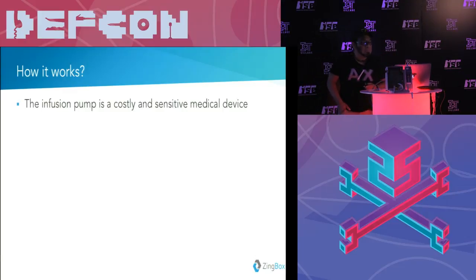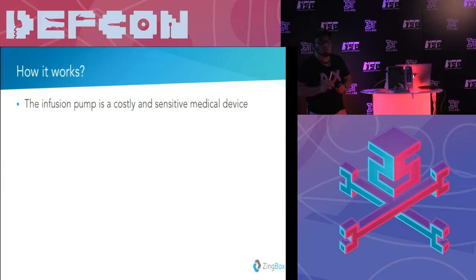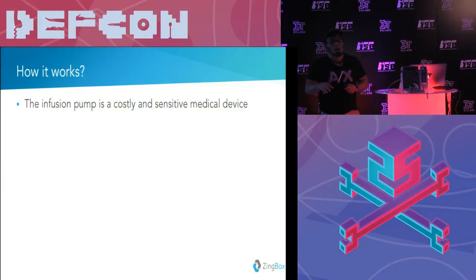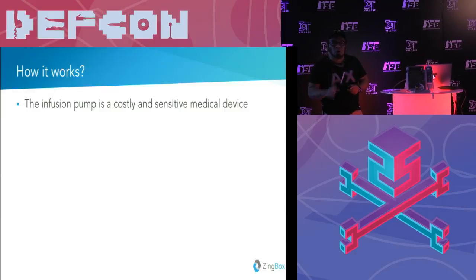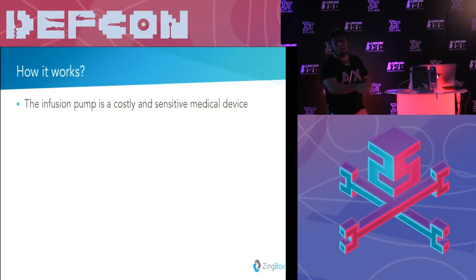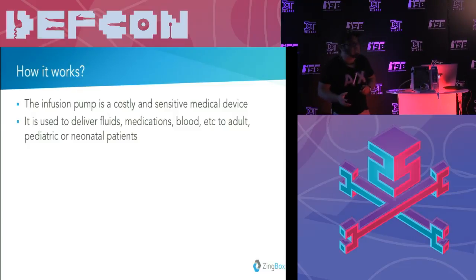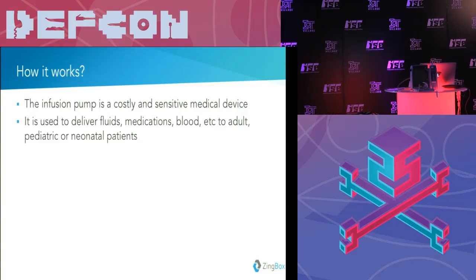The infusion pump is, first of all, very expensive. It's more than $1,000. In a hospital, you can see around 400 to 1,000 of these sitting in a facility, all of them connecting. It is used to deliver fluids, medications, blood, etc., to adult, pediatric, and neonatal patients. It goes all around the hospital, and they just plug it in. I'm going to show you in a second.